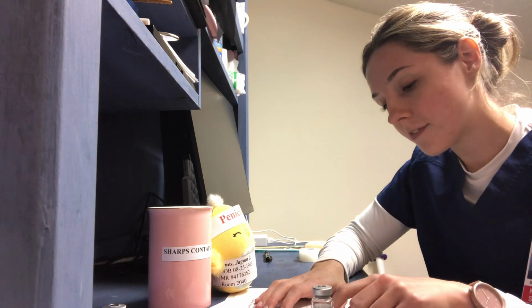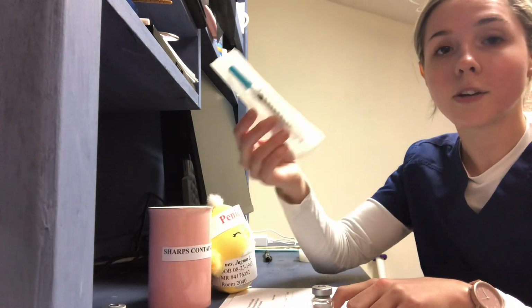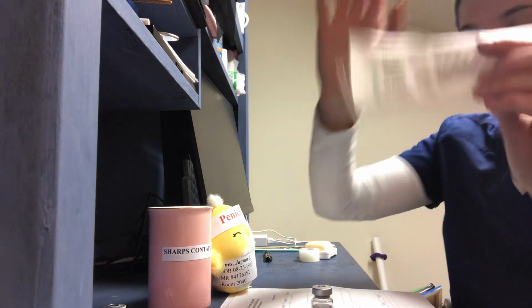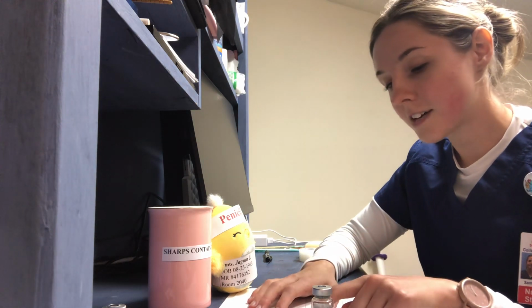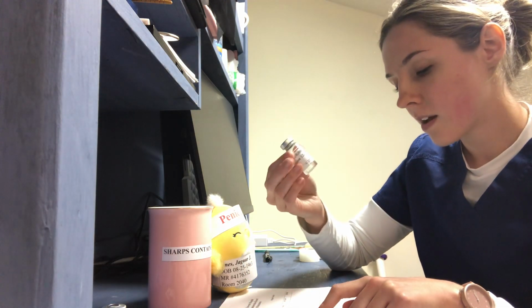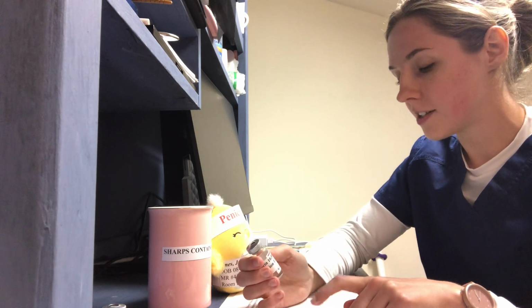Next, I want to make sure I have the right route. It is subcutaneously, so I'm going to select the correct needle and syringe, which is a tuberculin syringe. Here it is. And I want to make sure I have the right dose. So we need 5,000 units. I have heparin 10,000 units per milliliter. So I know I need half a milliliter for this to be 5,000 units according to this.